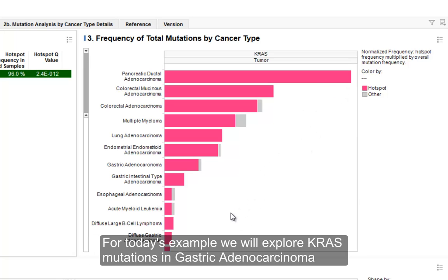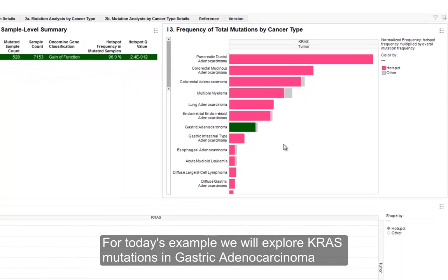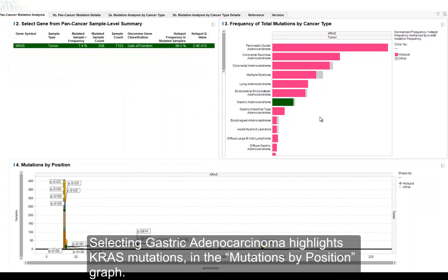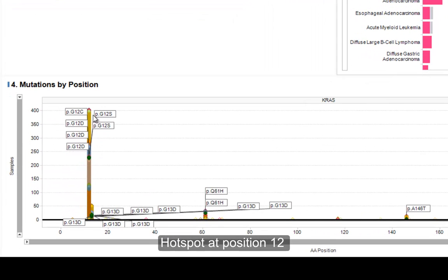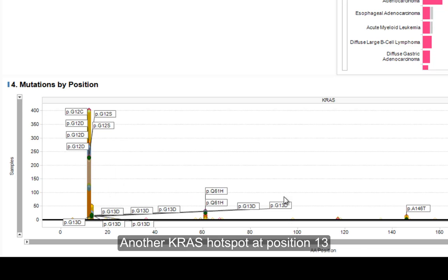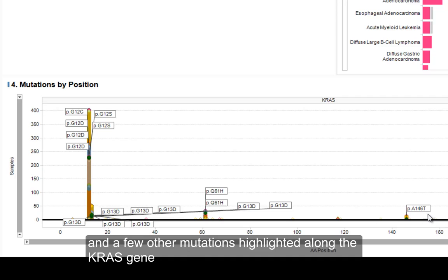For today's example, we're going to investigate KRAS mutations in gastric adenocarcinoma, so I'm going to select gastric adenocarcinoma. When I select that, it highlights the mutations in the mutations-by-position graph below. You can see there is a large hotspot at position 12, with several mutations from gastric adenocarcinoma, and then another hotspot at position 13, and then a couple of others along the KRAS gene.